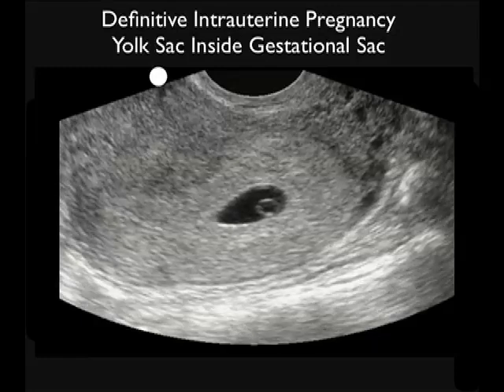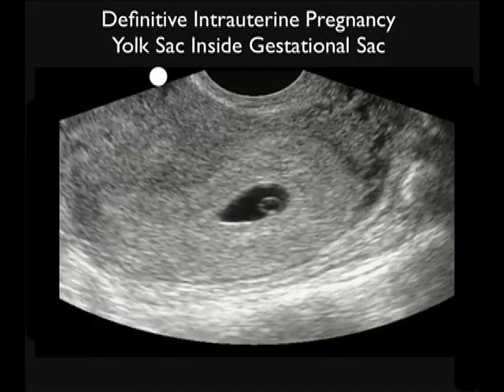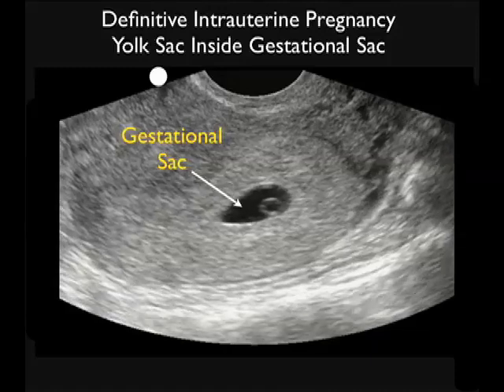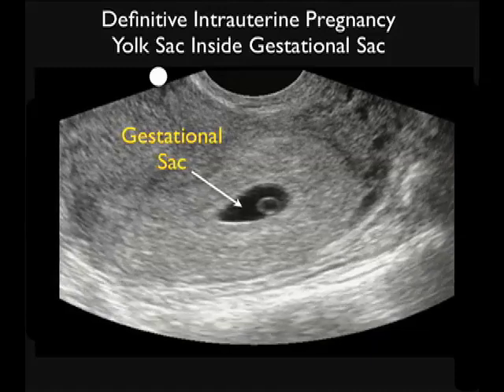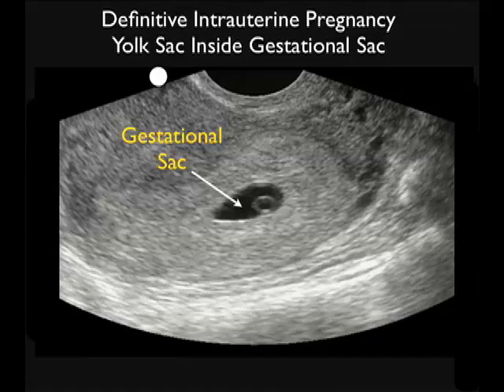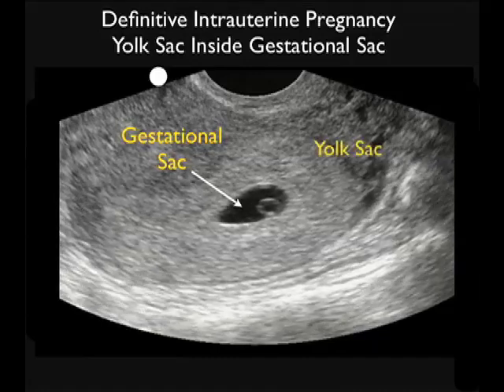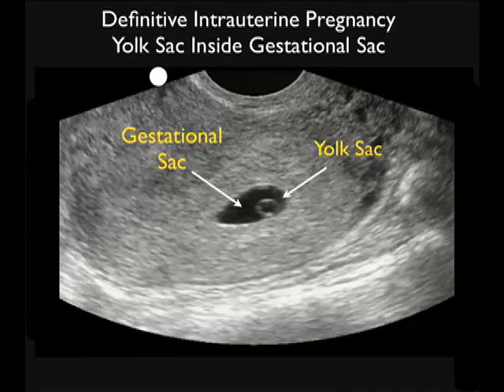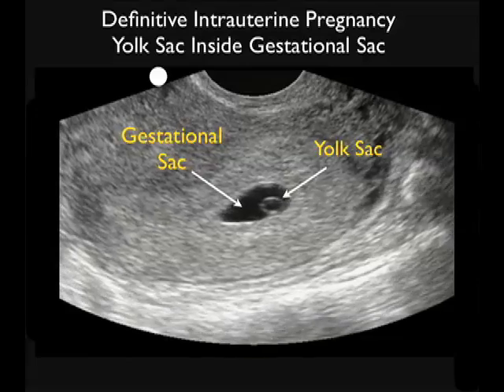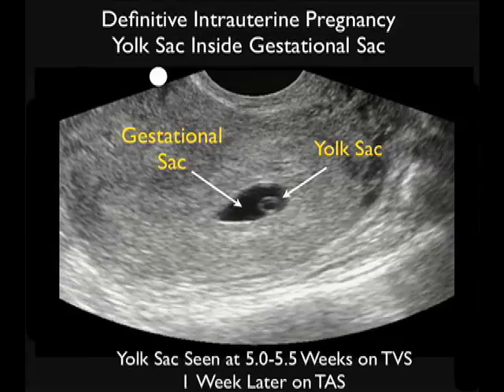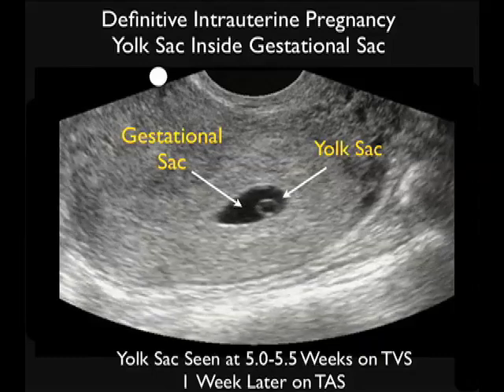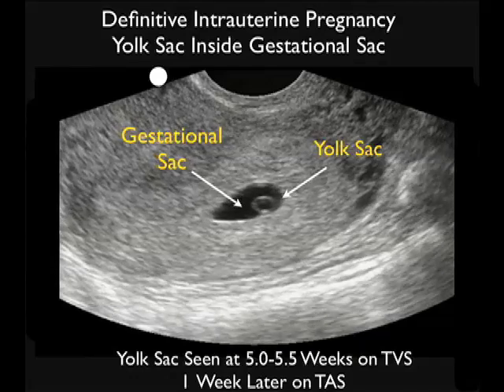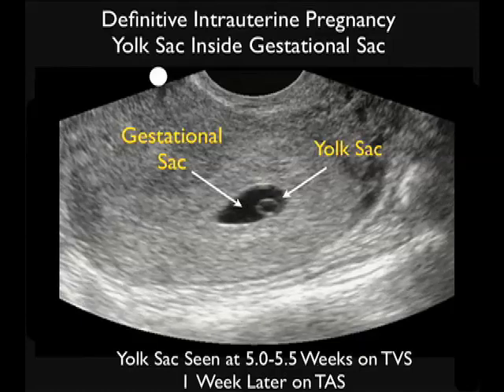Here's a video clip showing a definitive intrauterine pregnancy. We see a larger gestational sac, and inside we see the positive yolk sac, or cheerio sign. Notice the circular yolk sac towards the inferior aspect of the gestational sac. This is diagnostic of an intrauterine pregnancy, effectively ruling out ectopic pregnancy in the vast majority of patients. Remember, the yolk sac is seen at about 5 to 5.5 weeks on transvaginal sonography and about a week later on transabdominal sonography.